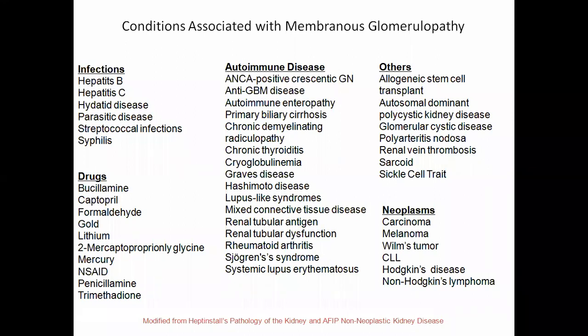It becomes difficult on a routine kidney biopsy to see that, because sometimes there will be some tubulointerstitial changes. Sometimes there will be mesangial proliferation, mesangial hypercellularity, or endocapillary proliferation. Whenever there is endocapillary proliferation, crescent, or mesangial hypercellularity, these findings suggest that most likely we are dealing with a secondary membranous rather than primary, because primary membranous should not show any endocapillary hypercellularity or extracapillary proliferation or crescent formation.